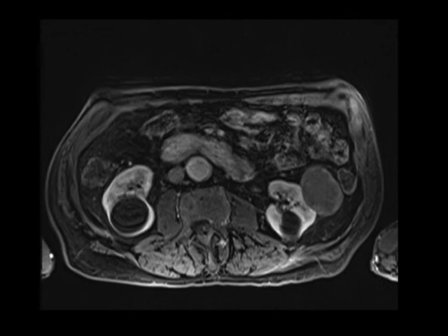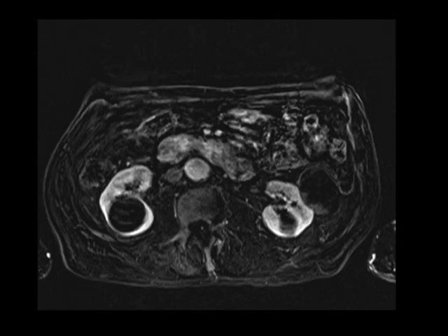This is an example of a papillary renal cell carcinoma — very faint, very subtle enhancement. The enhancement tends to be greater as you go along in the later phases: venous and delayed. Often the subtraction images are going to be vital in terms of identifying that rather subtle enhancement.